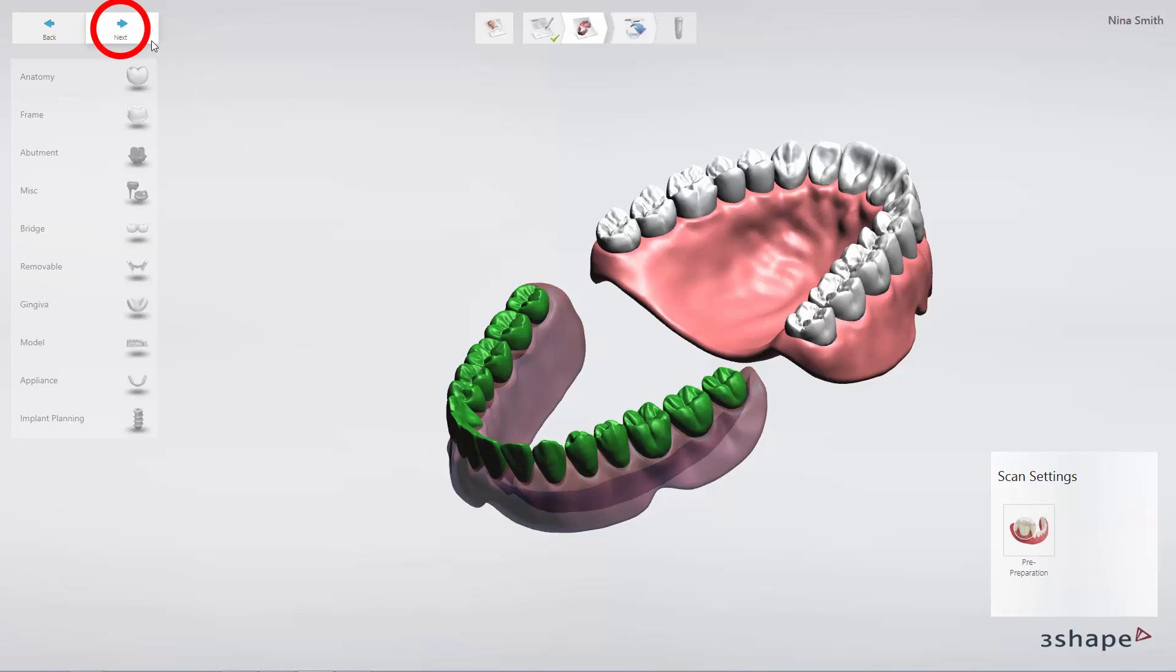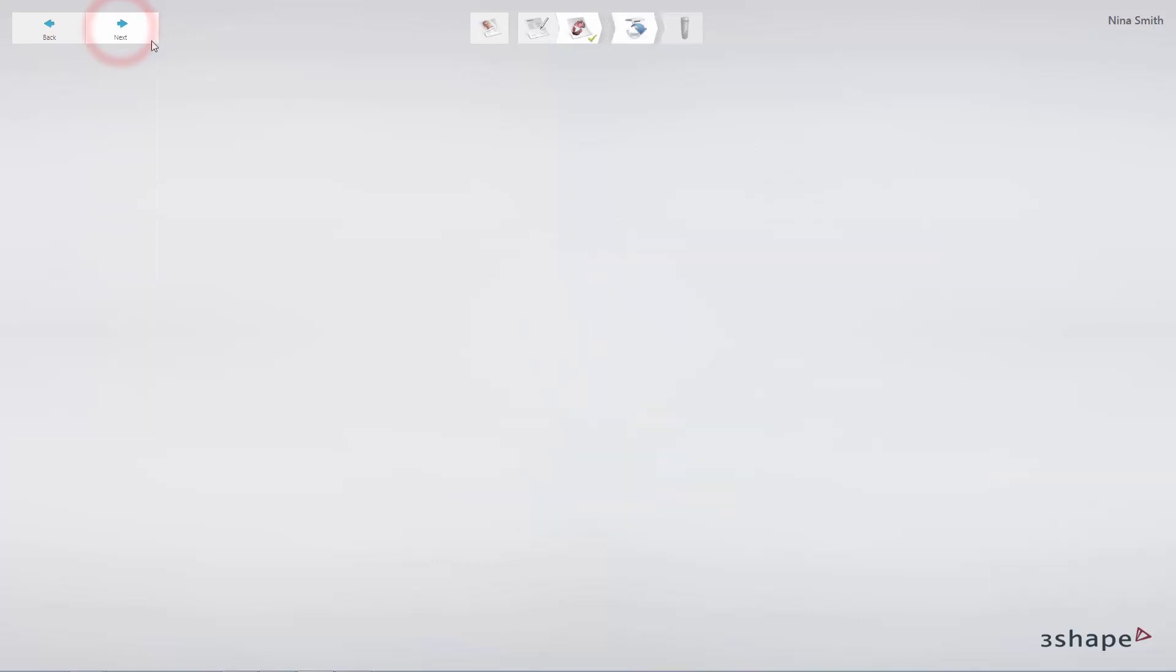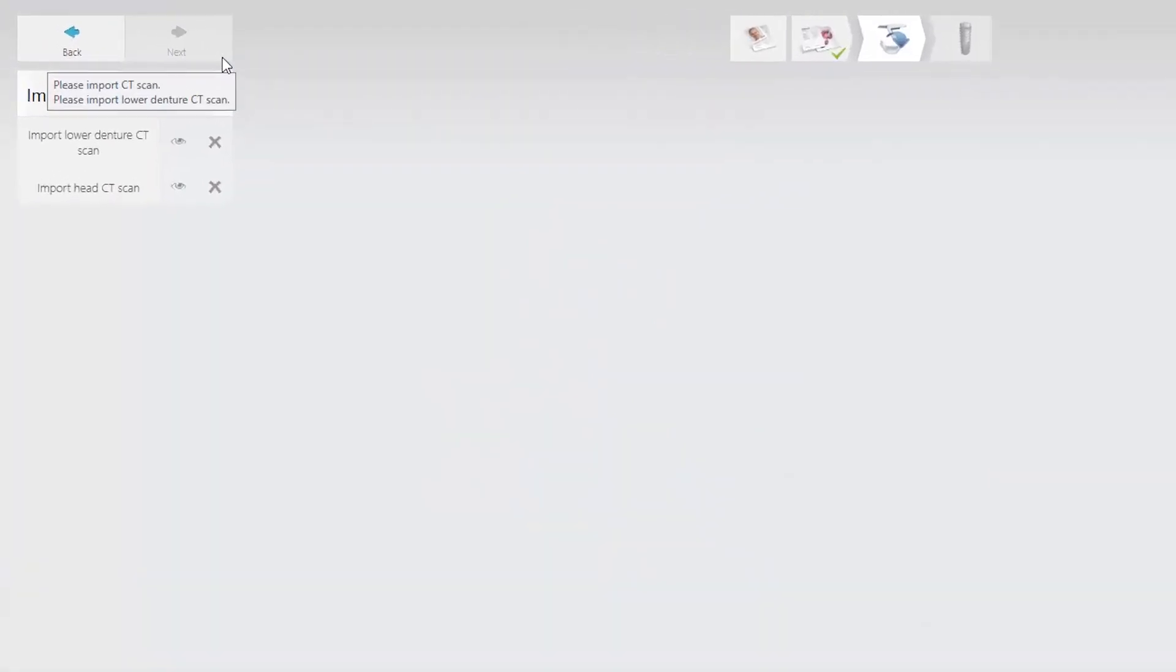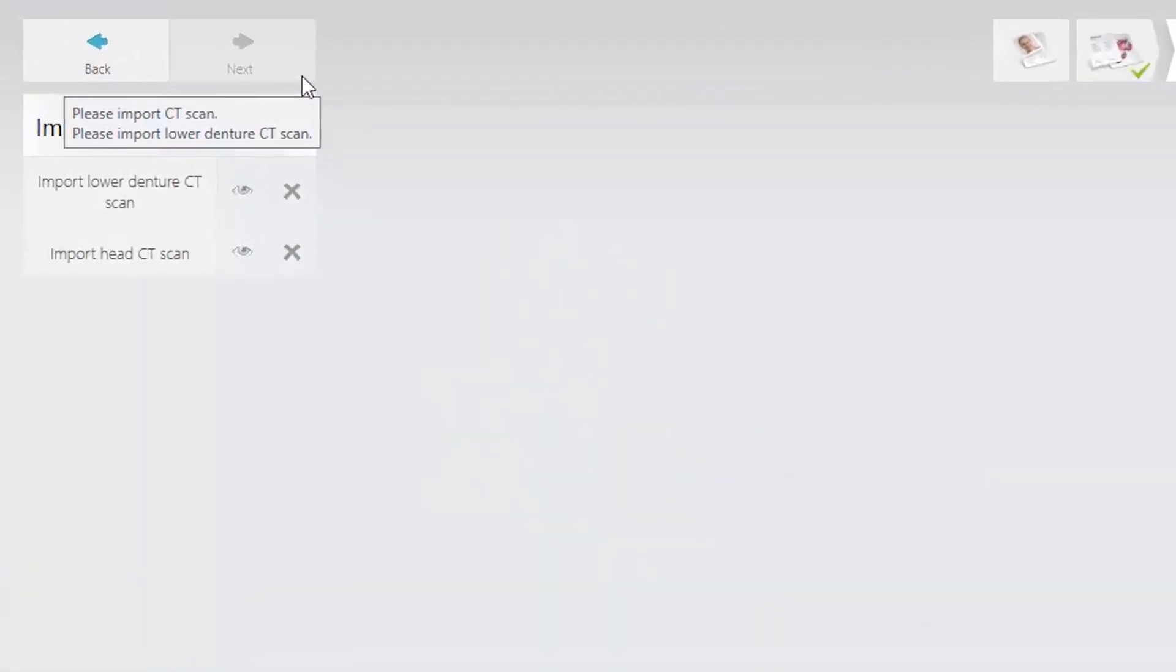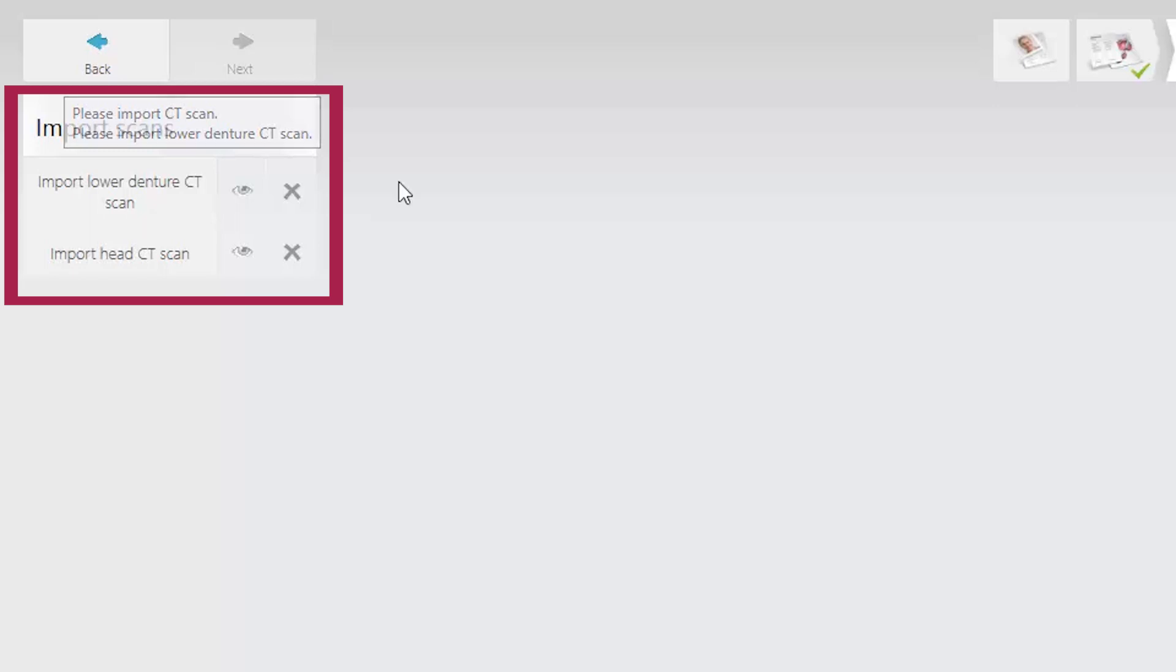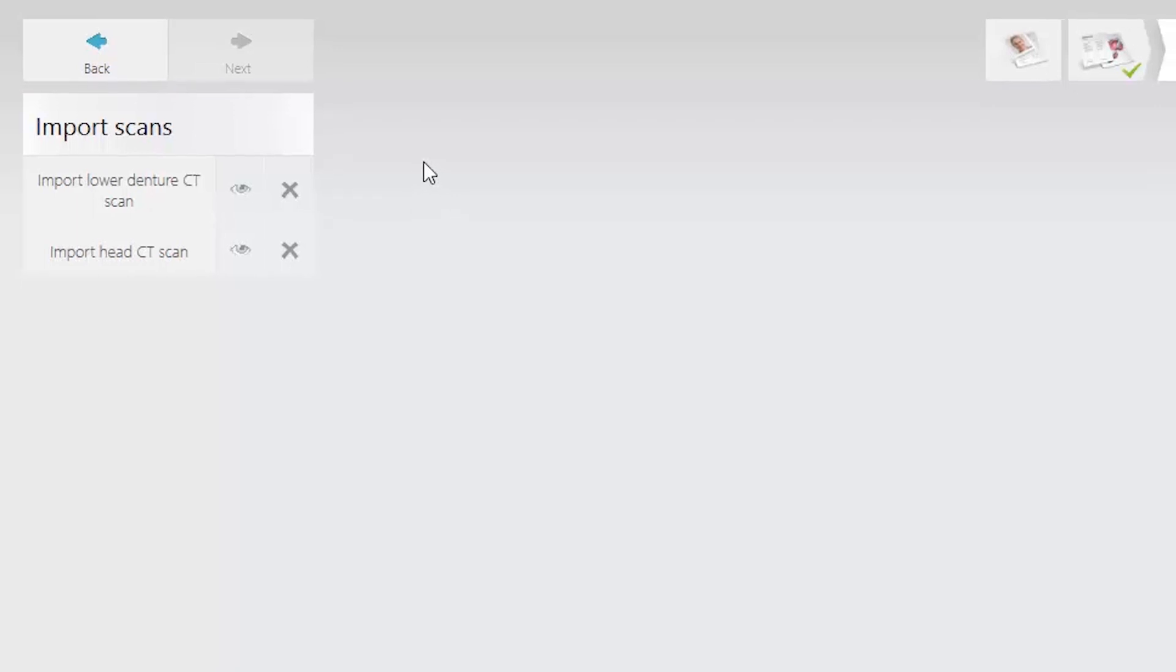Click Next to proceed to scan import. The workflow is based on two CBCT scans, often referred to as the Dual Scan Protocol. A patient CT scan and a denture CT scan are required.